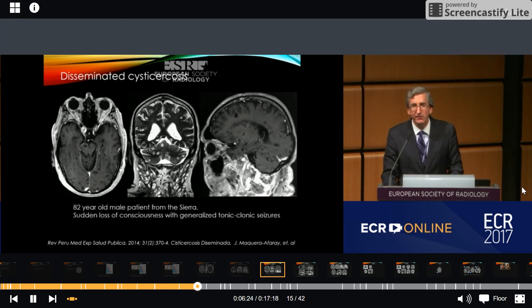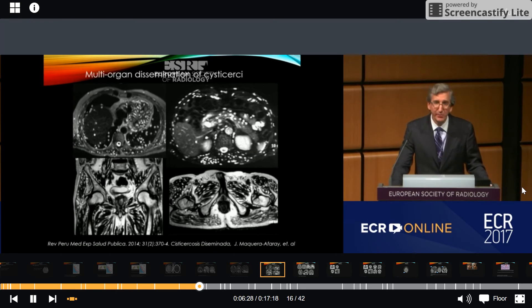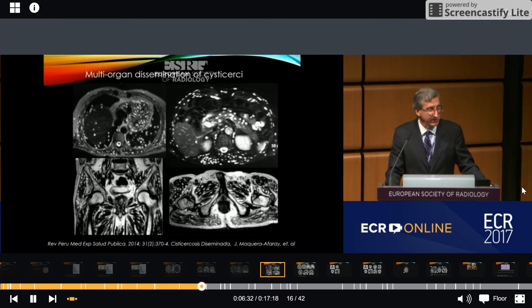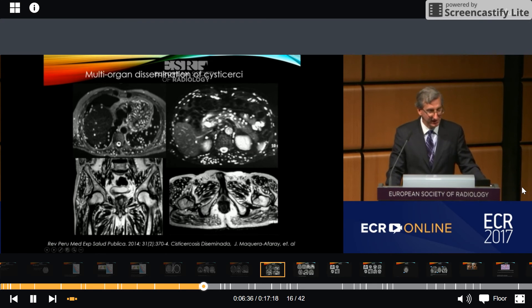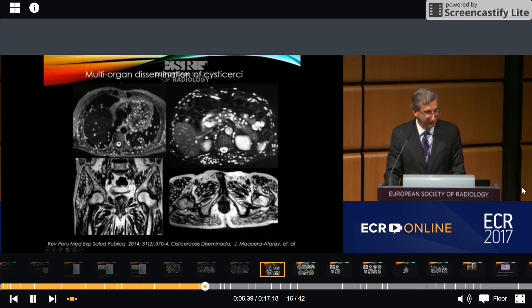This patient received deworming treatment. Here, in the same patient, we can see multi-organ dissemination of the cysticercus, including the heart, the lung, the pancreas, and all the muscles, as you can see here.